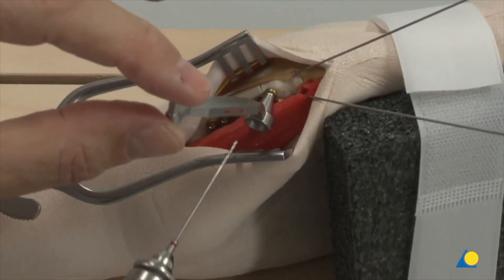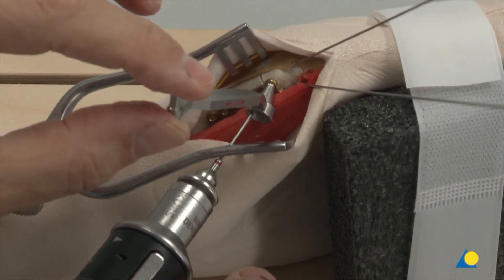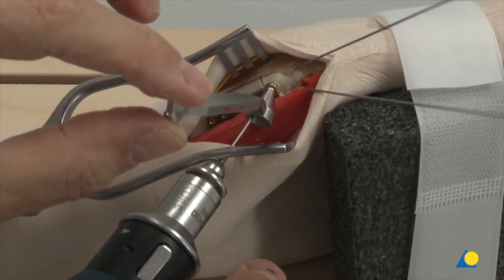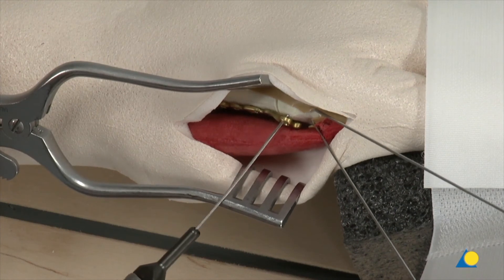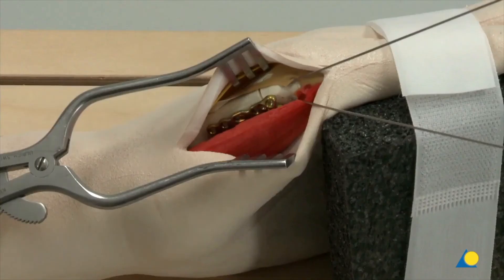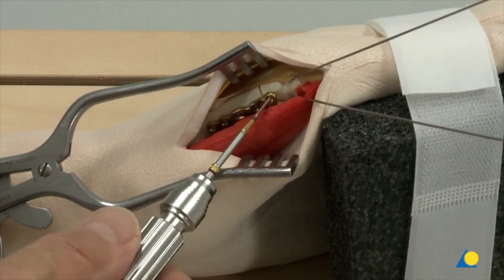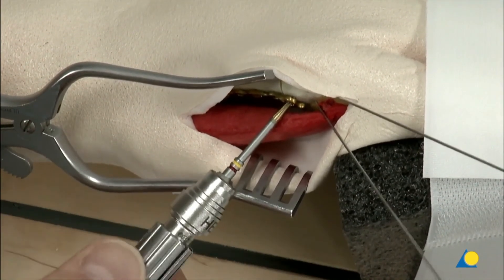The first locking screws will be inserted in either of the most distal holes of the plate head. Screw and wire interference must be avoided when placing the screw in the variable angle hole. The hole is drilled with the 1.1 mm drill bit and the 1.1 mm variable angle double drill guide. In a clinical situation, to avoid penetration of the far cortex of the metacarpal head, the drilling must be done under image intensification. The depth is measured and the screw is inserted using the self-retaining star drive screwdriver. Image intensification is used to confirm screw placement and length.